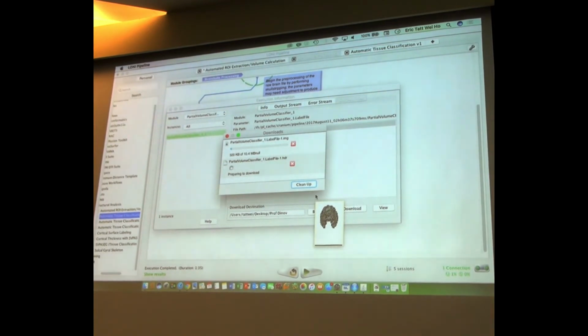But at any rate, the resulting volume here, the input was a raw image. The resulting volume is a stepwise function that has, I guess, 2 for the gray matter, 5 for the white matter, and 8 for the cerebrospinal fluid or something like this. Everything else is 0, right? So that's a result. And then once you have that image, you can pipe it through FSL stats to compute, well, what's the volume of the gray matter, what's the volume of the white matter, what's the volume of the CSF. These are derived neuroimaging biomarkers, right?